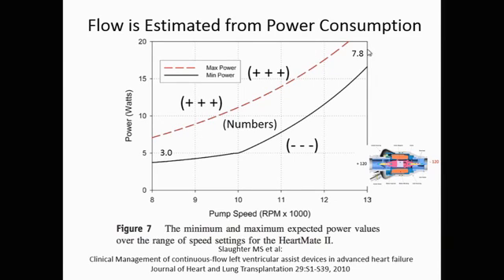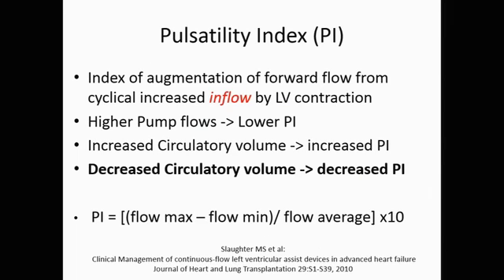All of these devices could have a curve like this that you could paste in your conference room, just like we have. The pulsatility index is very important. The outflow of these devices is determined exclusively by their inflow. The device will pump pretty much as much blood as gets into it.